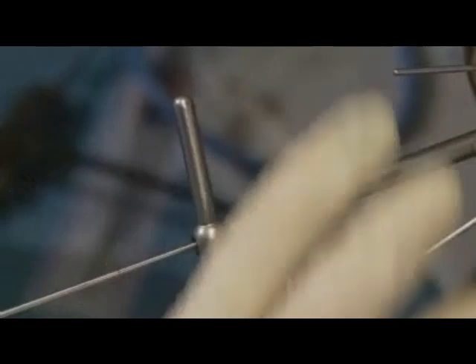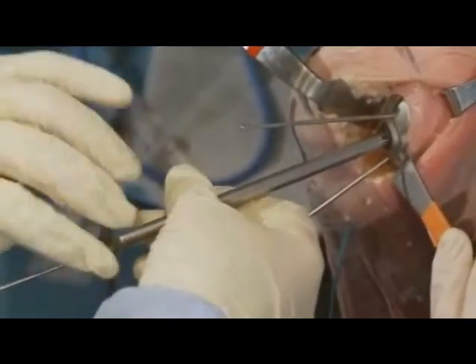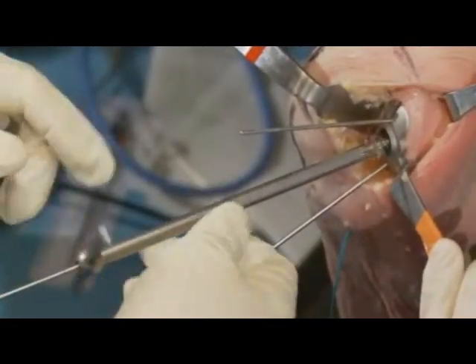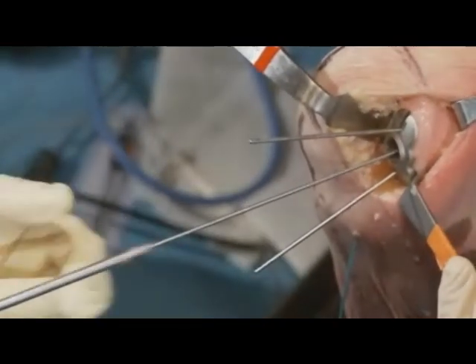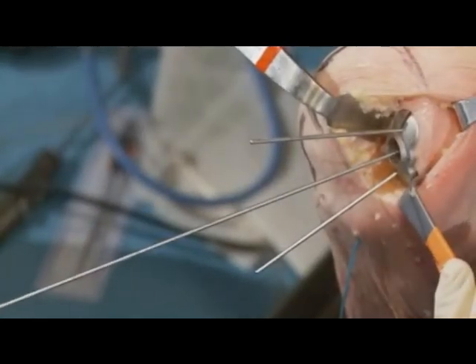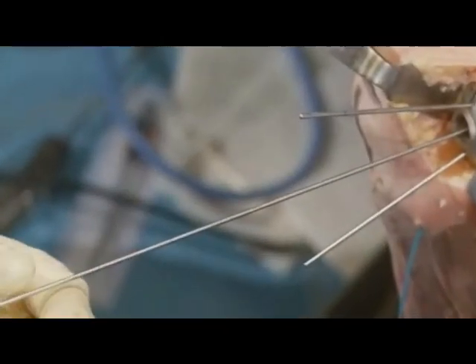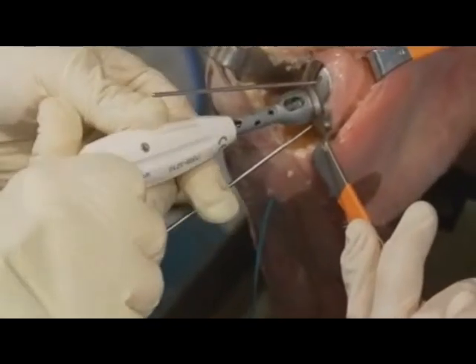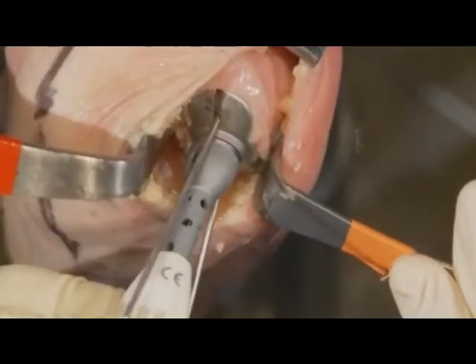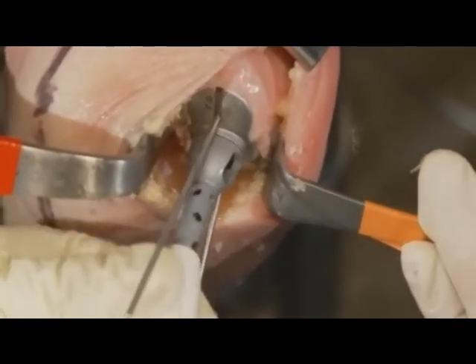You take it all out. You're always checking your alignment to make sure that everything is in line. That gets your screw in the right position. So we take all this out, and the next thing we do is put our screw into position and take our drill out. Now, the screw, initially we just set it in here so we can get it in the appropriate line. Then we have a way of tightening it down to the appropriate depth, because it's important to know the depth of the screw because that sets the height of the implant. Okay? So we just screw this whole assembly together to set the screw, make sure everything's in the right position.